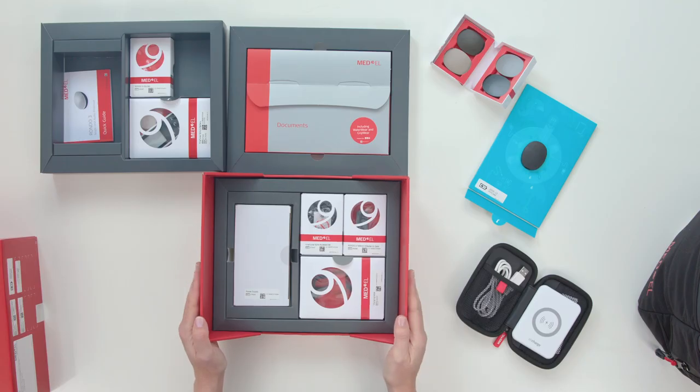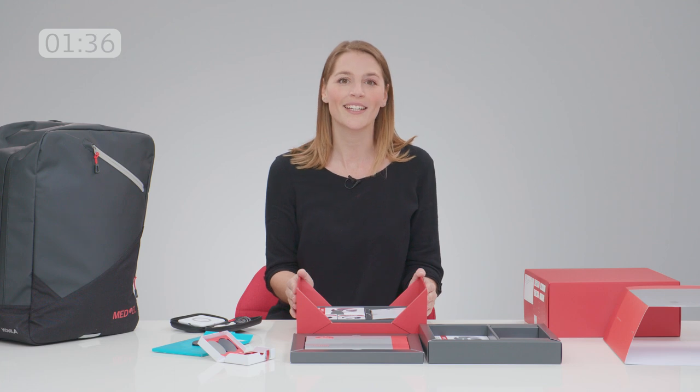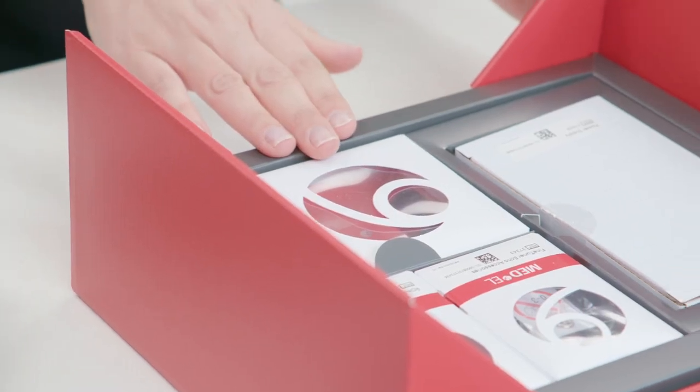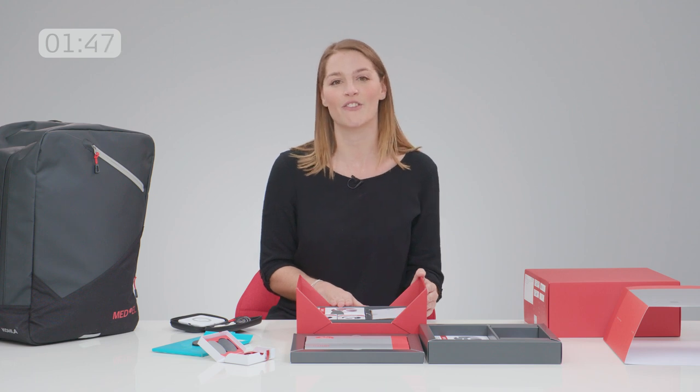We have some more convenient accessories such as the small telecoil adapter for easy connectivity with hearing loop systems. And if you have a normal power bank, you can even charge your Rondo 3 on the go while hearing. That's what this cable is for — very useful in case you're traveling or just forgot to charge the Rondo 3 overnight.